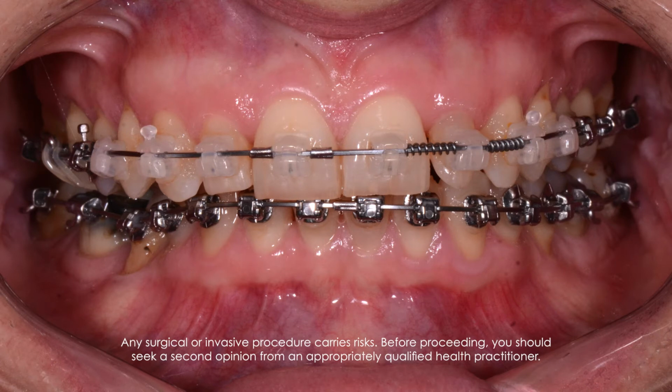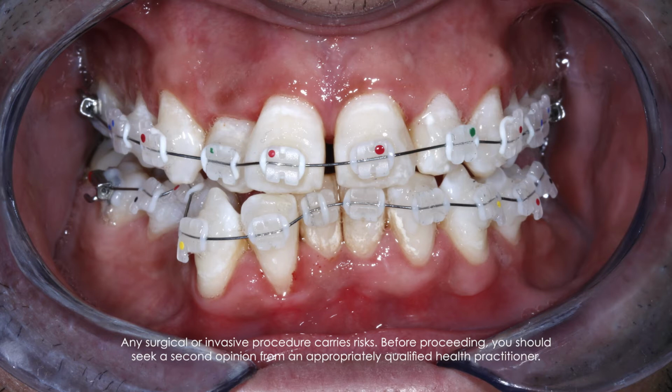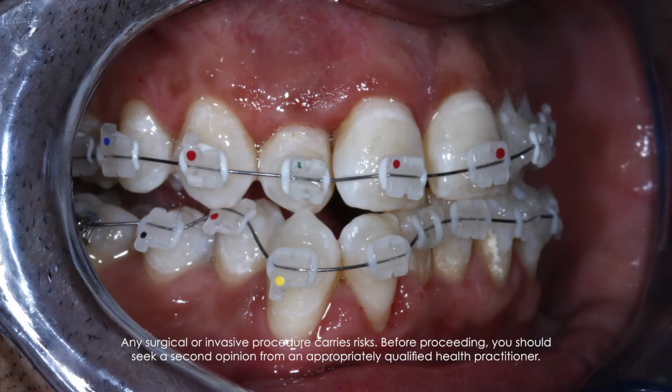Now, remember I mentioned to you before, we've got metal braces versus ceramic braces. The difference between metal and ceramic braces only has to do with the color or the material that we use for the brackets. The ceramic brackets are generally more fragile, meaning that they're a bit more brittle, and over time there are a bit more replacement issues as you go along. And number two, sometimes they may be less effective because when they break, you need to wait for a while to get an appointment to come in, so this may actually prolong your treatment time slightly.